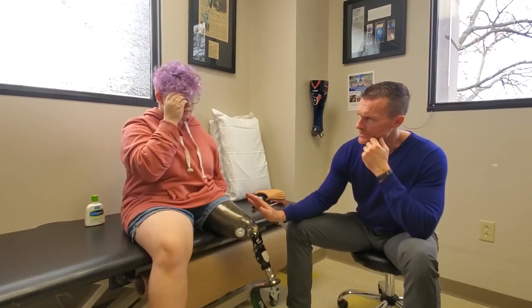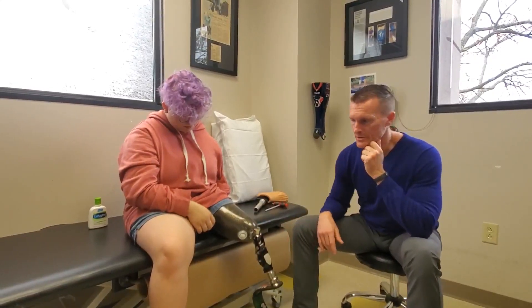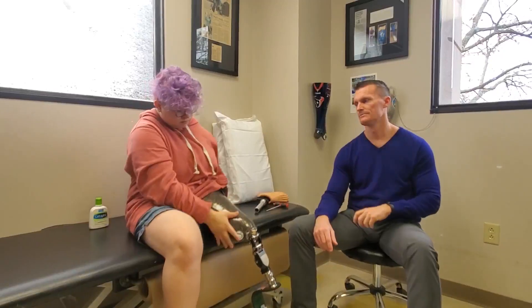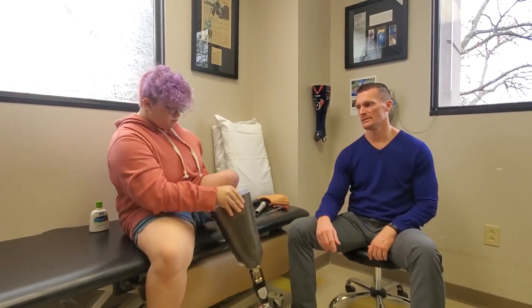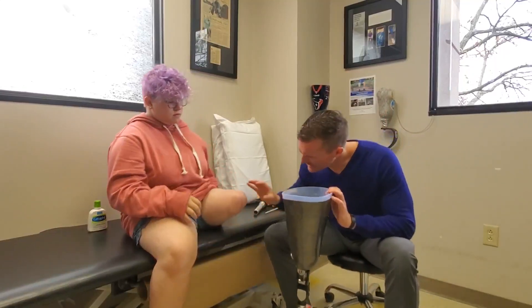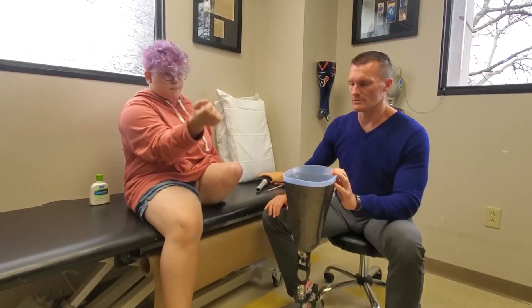Do you think there's enough lotion on here to take it on and off? Mm-hmm. She's going to show you real quick how she gets it on and off — it's really easy — and I'll show you the socket design. She pushes the button, gets it loose enough. Yeah, that looks a little better right there. So the flushness of the valve is a little critical.